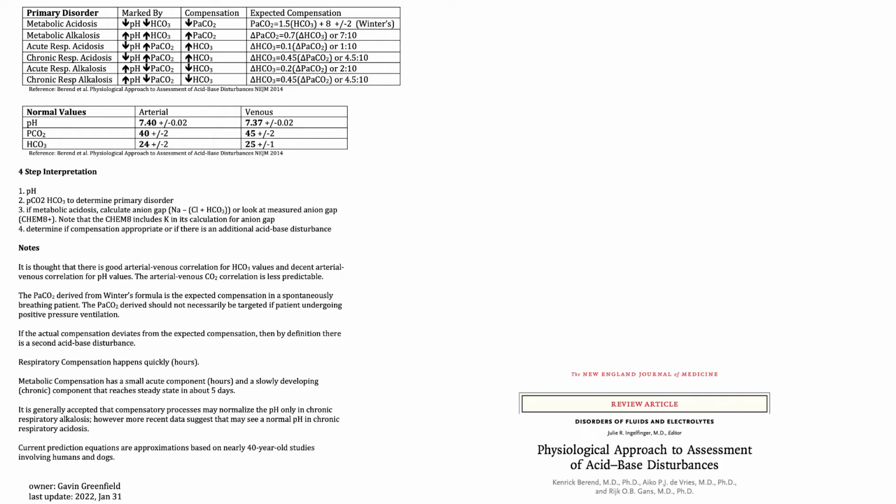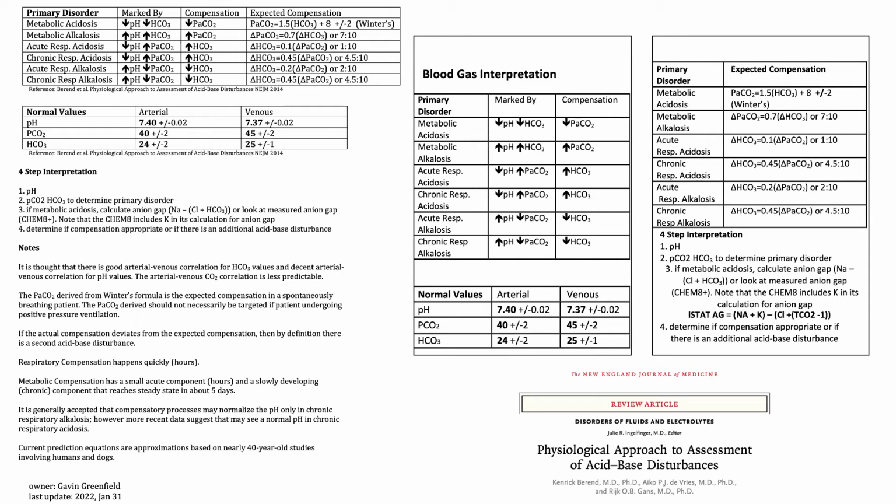The way we interpret blood gases at STARS is called the physiological approach. It's the most common approach to blood gas interpretation that's out there, but there are other approaches, just so you know. A few months ago, Mackenzie Wardle gave us a little pocket version of this one-pager. So thanks again to Mac. If you don't have this, just reach out to Mac, drop him an email. He'll be happy to send this along, so you could keep it in a more easily accessible hard copy version. I personally just keep the one-pager available in my Dropbox, which I have on my phone.